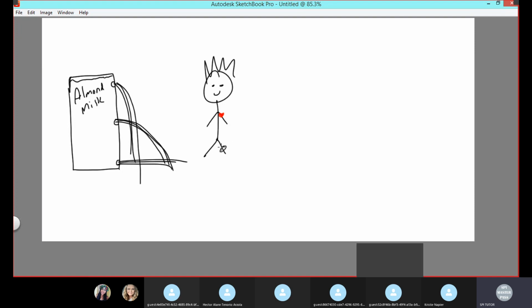Because if you take the blood pressure down here by the knee or the ankle, you have all of this blood pressing down on this vessel down here, on this artery down here, okay? And if you do that, it is going to increase your blood pressure. Now, it will increase the number that you read, okay? So it won't necessarily be like this is your actual blood pressure. It would be an incorrect reading.